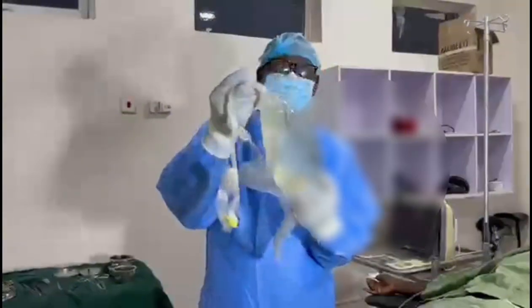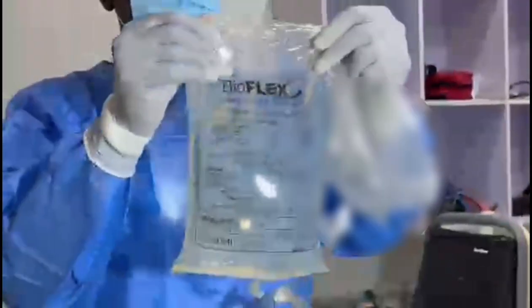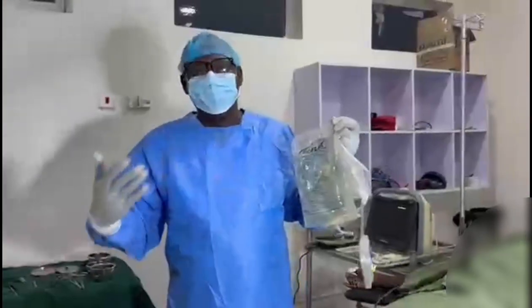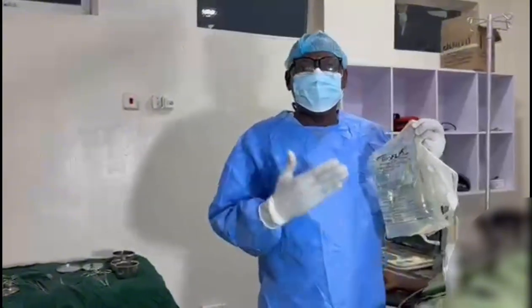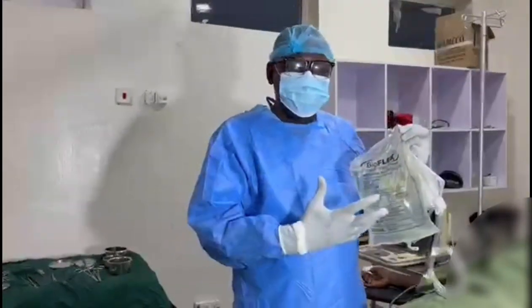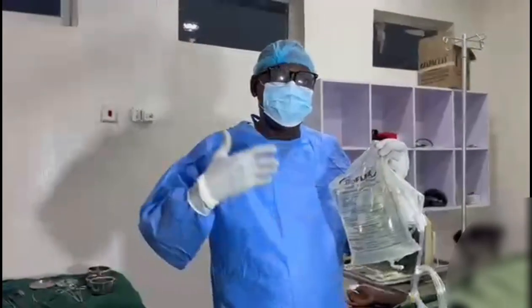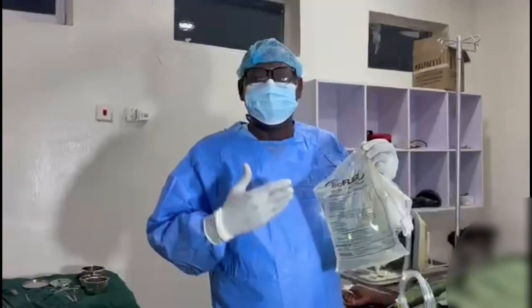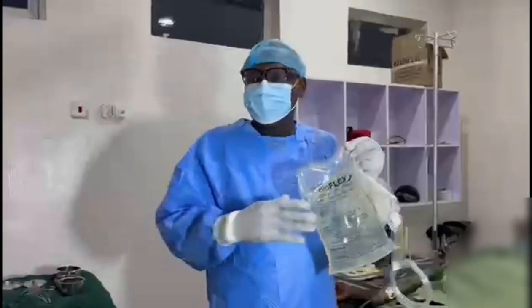What it looks like. Okay. This is 1.5% PD fluid. So when we put it into the peritoneal cavity, the patient carries it, goes about with it for about 2 hours, 4 hours, and after that he drains the fluid. After draining, that will come out with a lot of waste, and we continue that cycle about 3-4 times a day, and overnight we also leave the fluid to be in the peritoneal cavity.